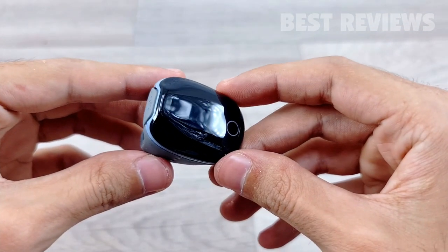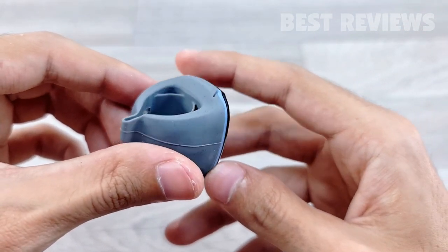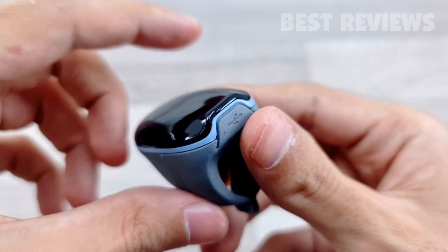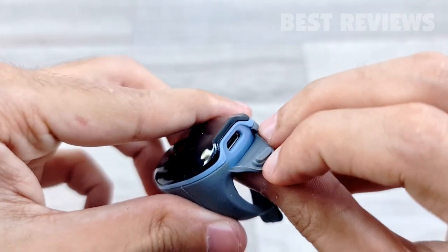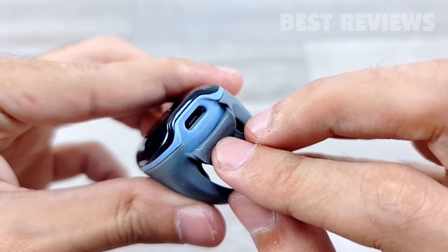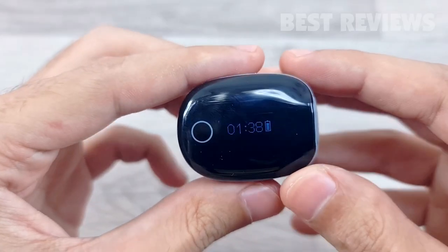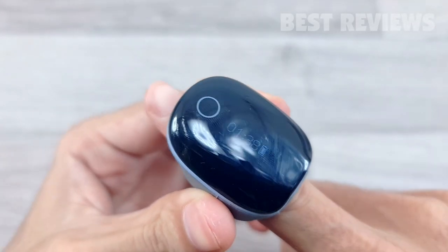The WellU O2 Ring is a wearable sleep monitor that can track oxygen saturation, heart rate, and movement continuously whilst you sleep. Designed as a ring to be worn on the thumb or index finger, the O2 Ring claims to be the lightest, smallest ring sensor for overnight continuous monitoring.